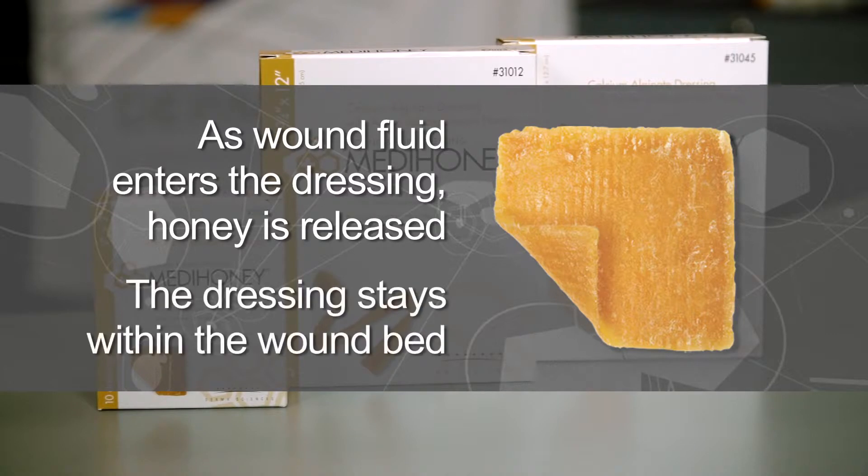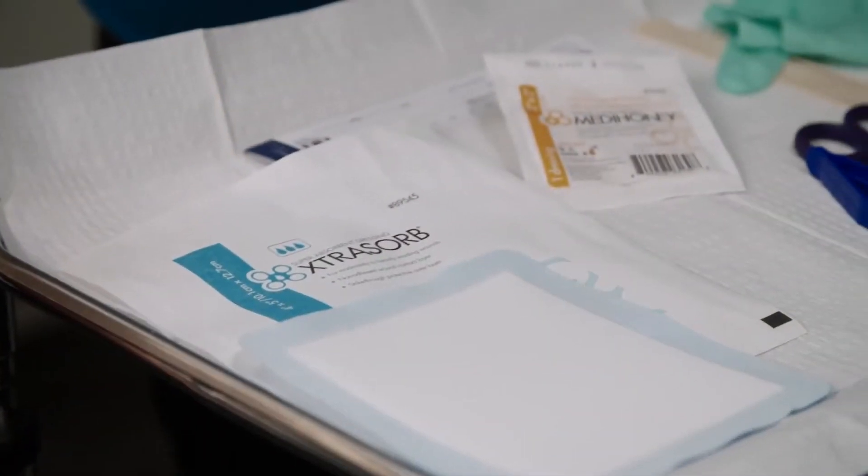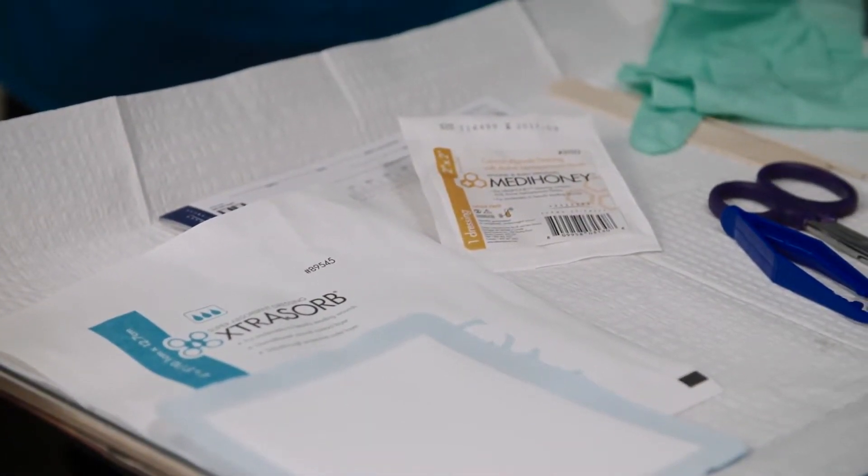MetaHoney Calcium Alginate dressings must stay within the wound edges to avoid peri-wound maceration, and must be used with a secondary cover dressing.